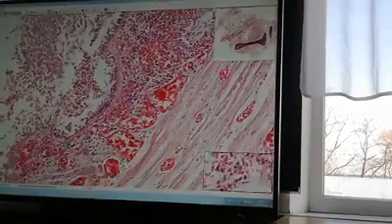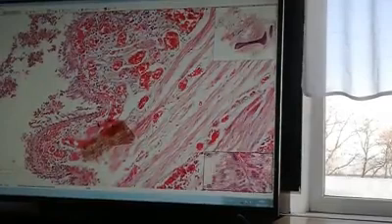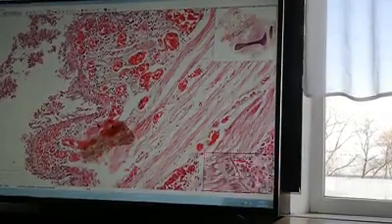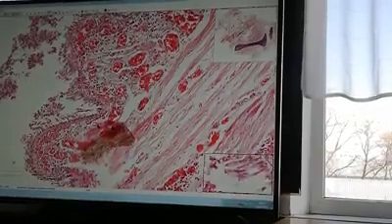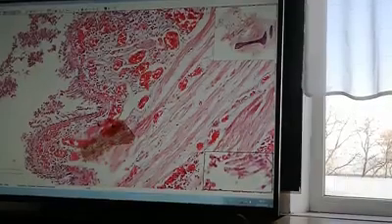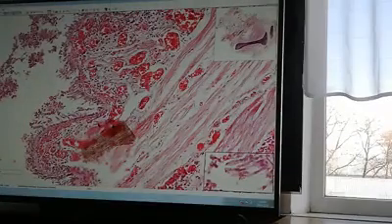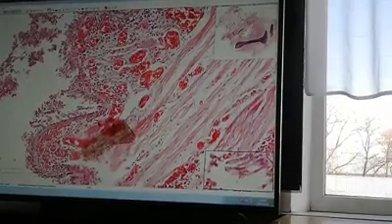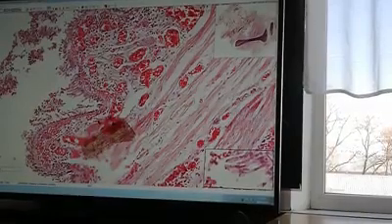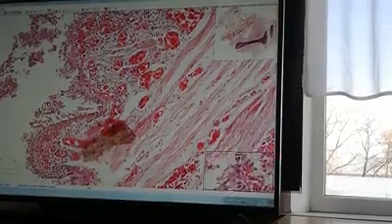After that, we are looking at the mucous membrane, at the columnar epithelium, and can find some strange appearance. This overgrown area of the epithelial layer underwent metaplasia. Squamous cell metaplasia. What is it? Metaplasia is a change of the epithelium or any other tissue within the same germ layer. So one type of epithelium to another, or one variant of mesenchymal tissue will transform to another. Epithelium to mesenchymal tissue is impossible.